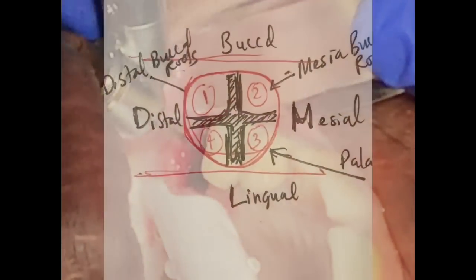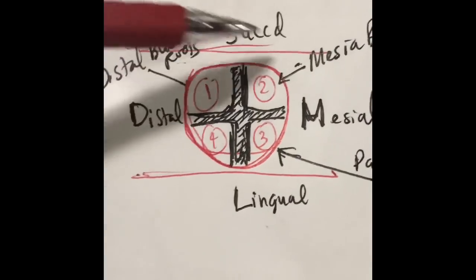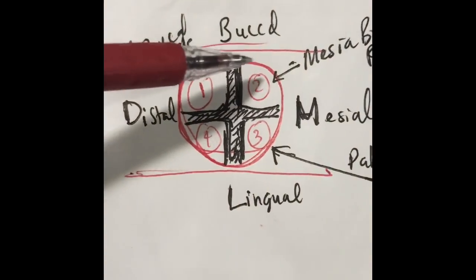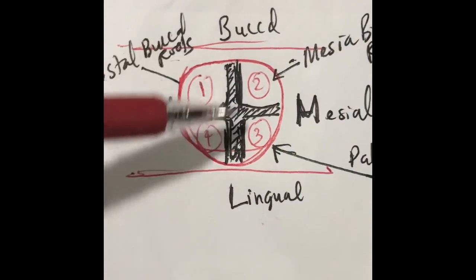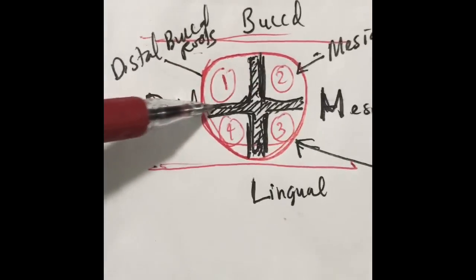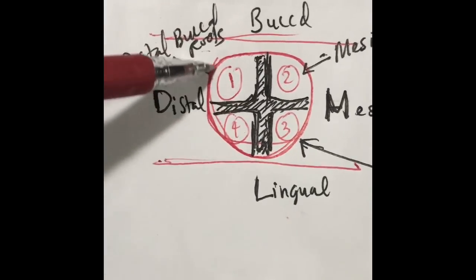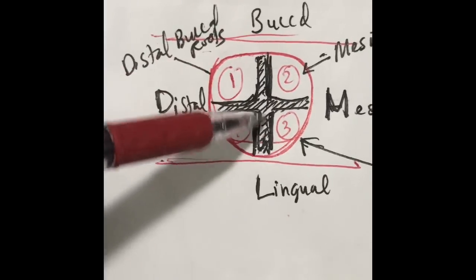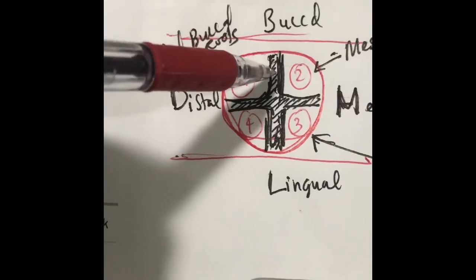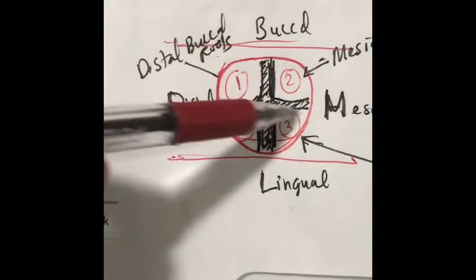You're looking at the root right now. You would cut from buccal to lingual, mesial to distal or distal to mesial. You cut it into 4 pieces. And then you take out 1, 2, 3, 4 pieces at a time. Once you cut, you put the straight elevator right here and twist it, and one of these will be released.